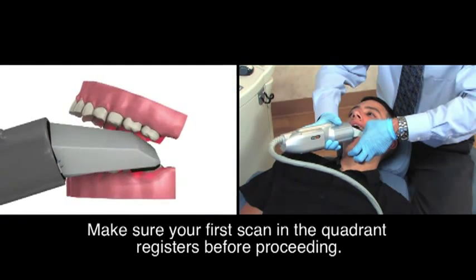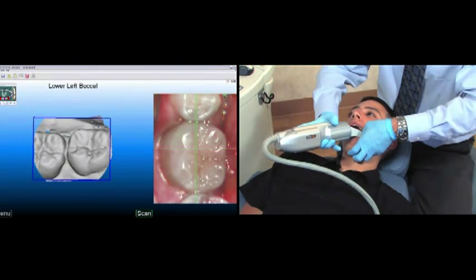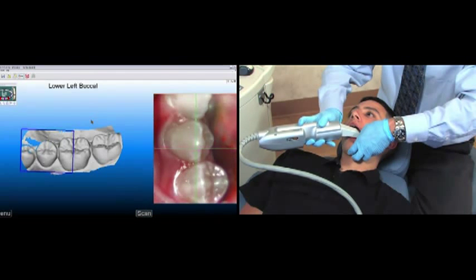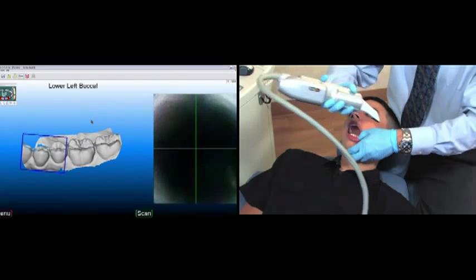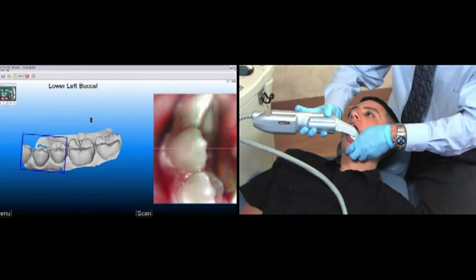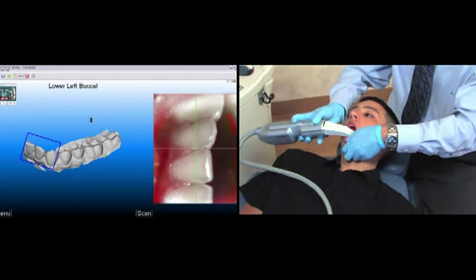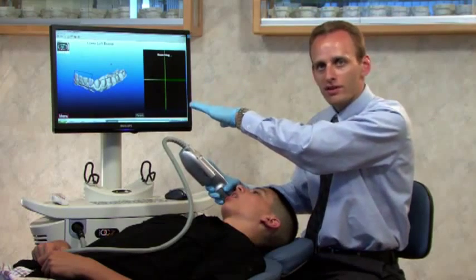Now I'll roll a little bit towards the buccal, then move one tooth mesial and keep moving forward, pressing the green foot pedal to take a scan. As I get towards the anterior, the scanner is going to turn with the shape of the arch. I'll want to scan just beyond the midline. At this point, I want to take a quick look to see that I captured everything within this buccal quadrant.